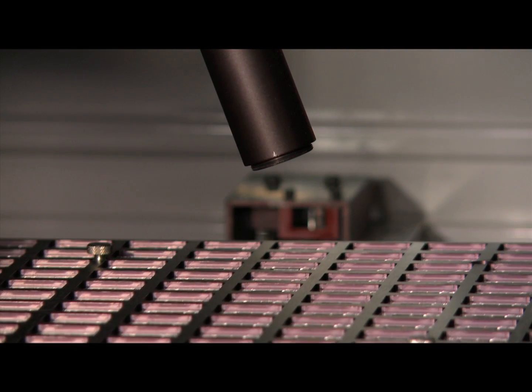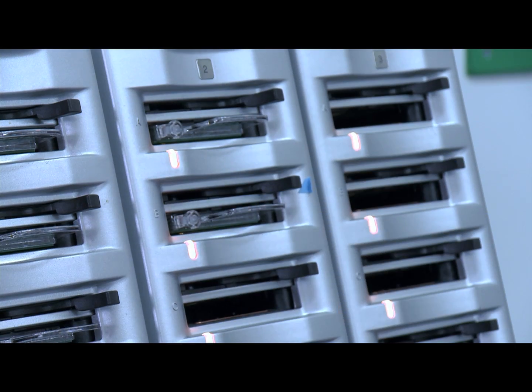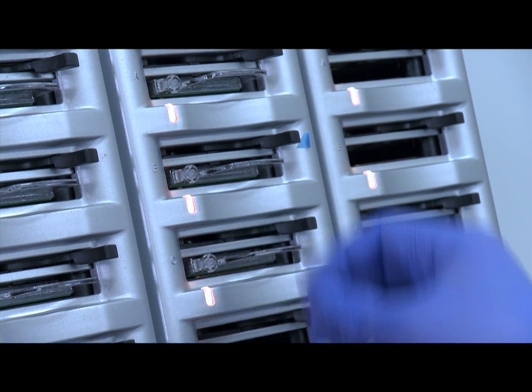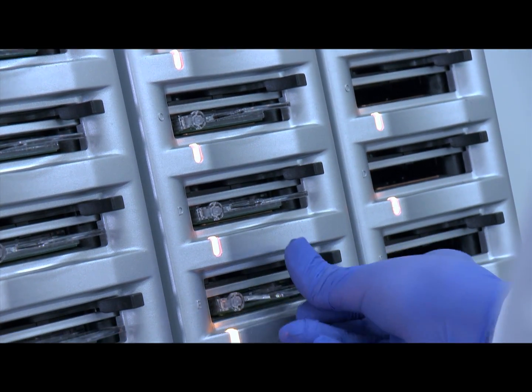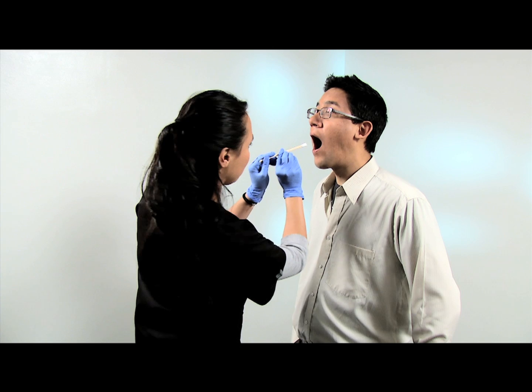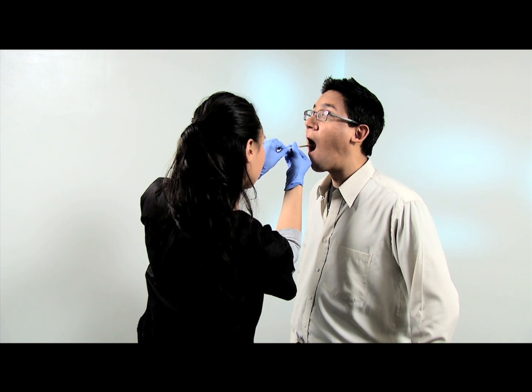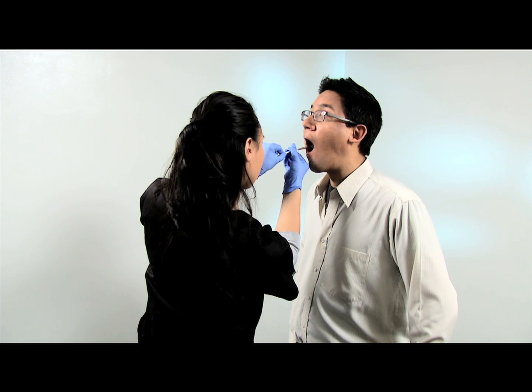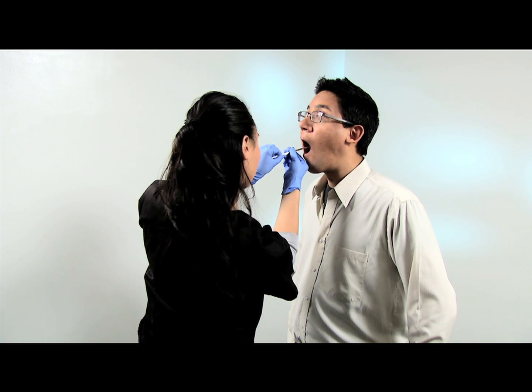At Natural Molecular Testing, our goal is to rapidly deliver 100% accurate results to our clinical partners and their patients. The process begins in your office. The Natural Molecular Testing procedure is simple, non-invasive, and can be administered by a nurse or clinician using buccal swabs. You will collect cells from inside the patient's mouth.